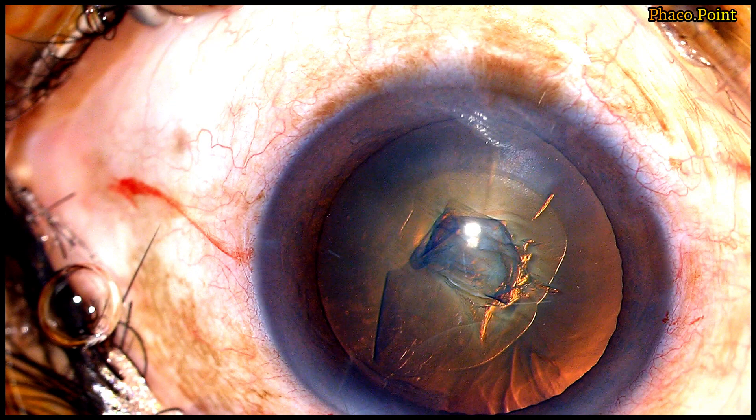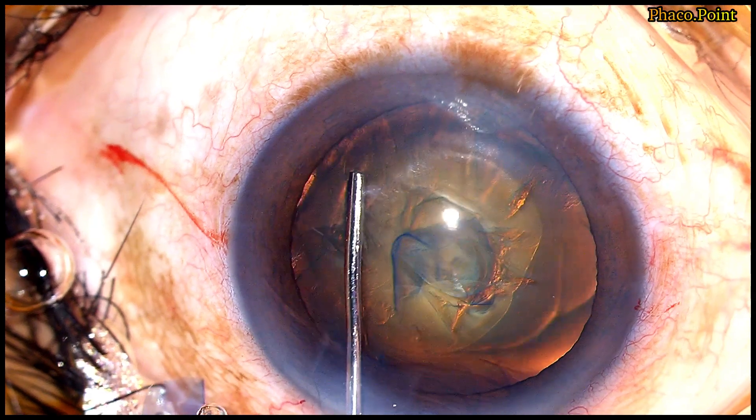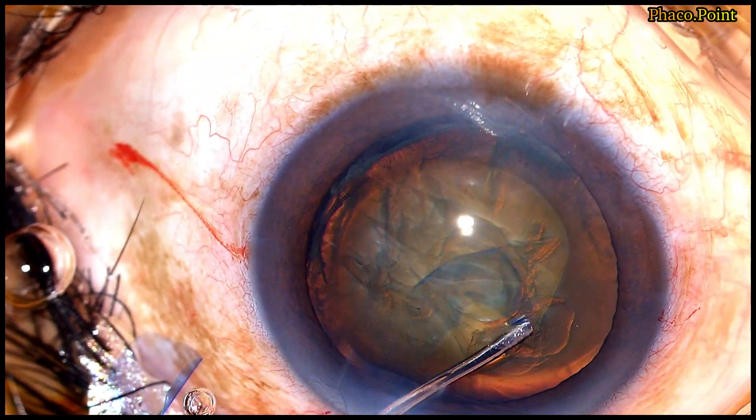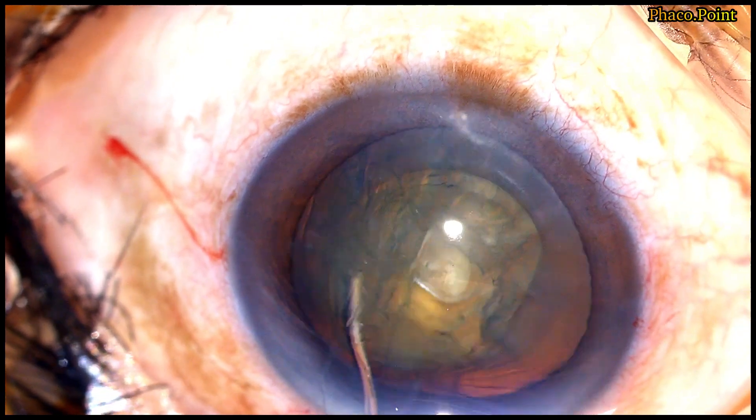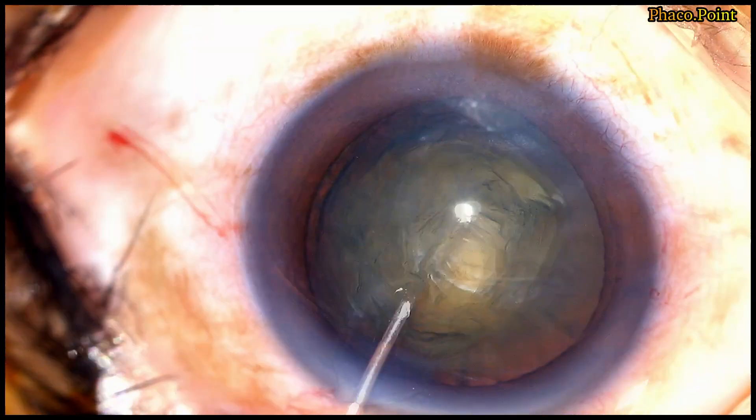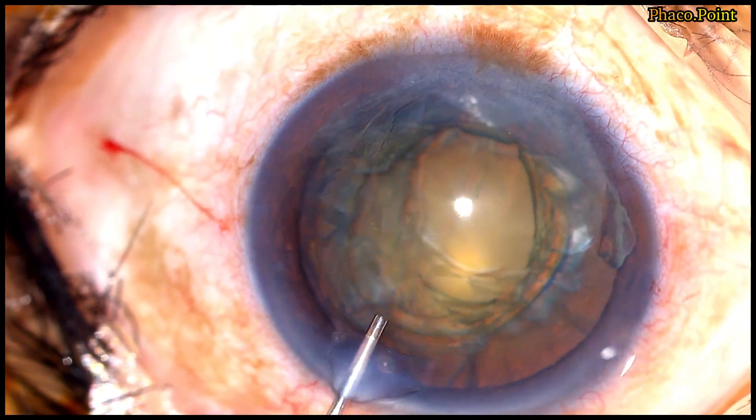In a soft cataract, I not only perform hydrodissection, I also perform hydrodelineation to demarcate the endonucleus prior to performing the pre-chopper. So now in this case, we perform the hydrodissection and the hydrodelineation.